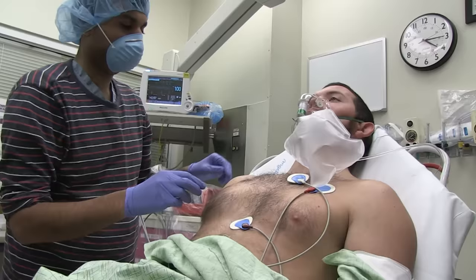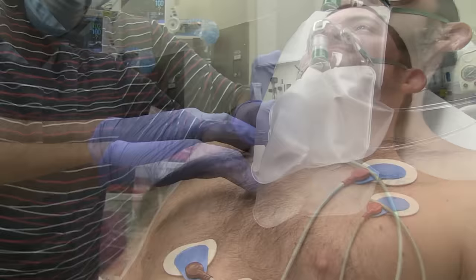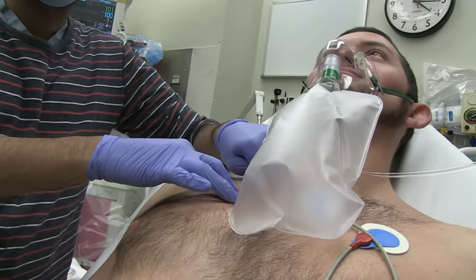Just to walk through the procedure, it's going to be second intercostal space, midclavicular line, where we'll be introducing our needle and our incision will ultimately be made. So I'm just feeling for my landmarks at this point. So you're using the TRU-CLOSE system? Yes. It's a chest tube that actually fits onto the chest as an apparatus, and doesn't require the atrium. It can be hooked up to low intermittent suction directly to our wall suction. So he can get up and actually walk around after he's had this placed. That's correct.